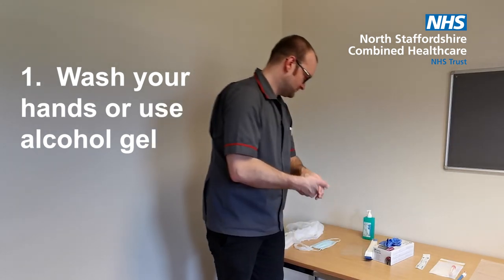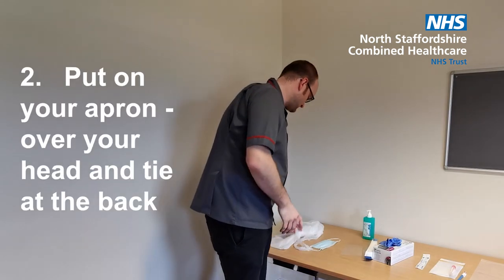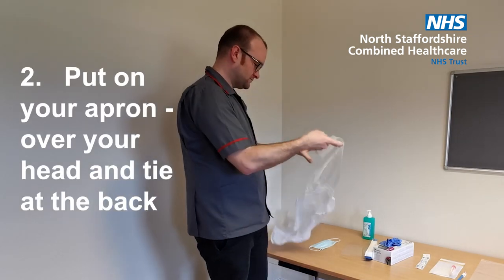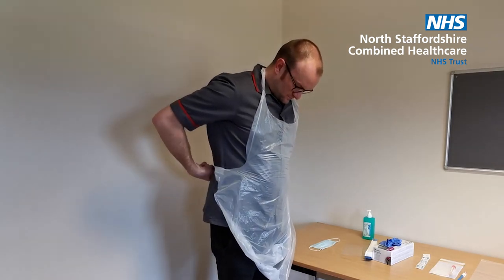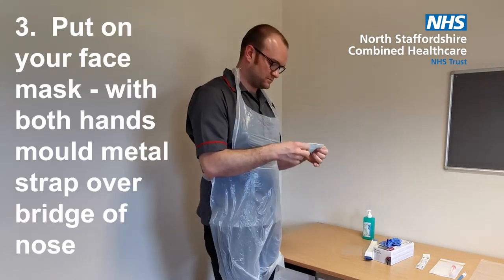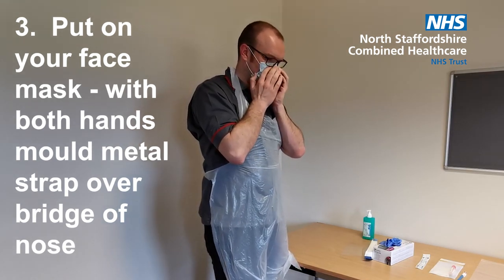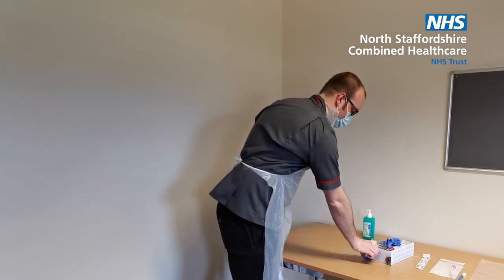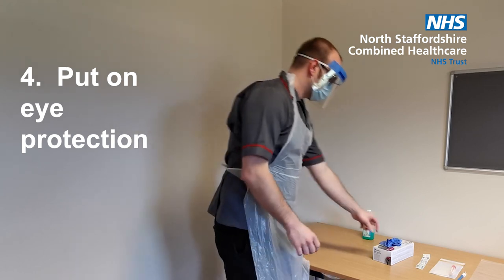So now we're going to show you how to put on your personal protective equipment. First of all, wash your hands or use alcohol gel. Then put on your apron — over the head and tie it securely at the back. Put on your face mask and with both hands, mould the metal strap over the bridge of your nose. Next, eye protection. And finally, gloves.